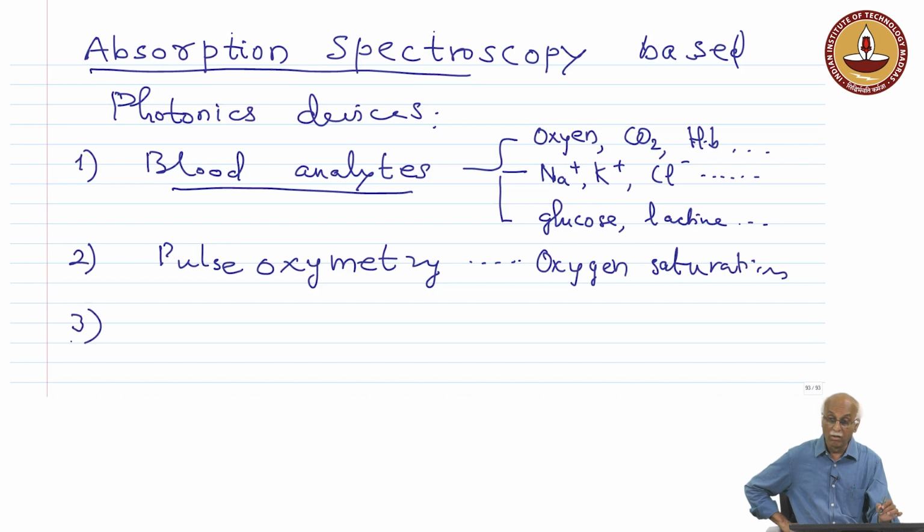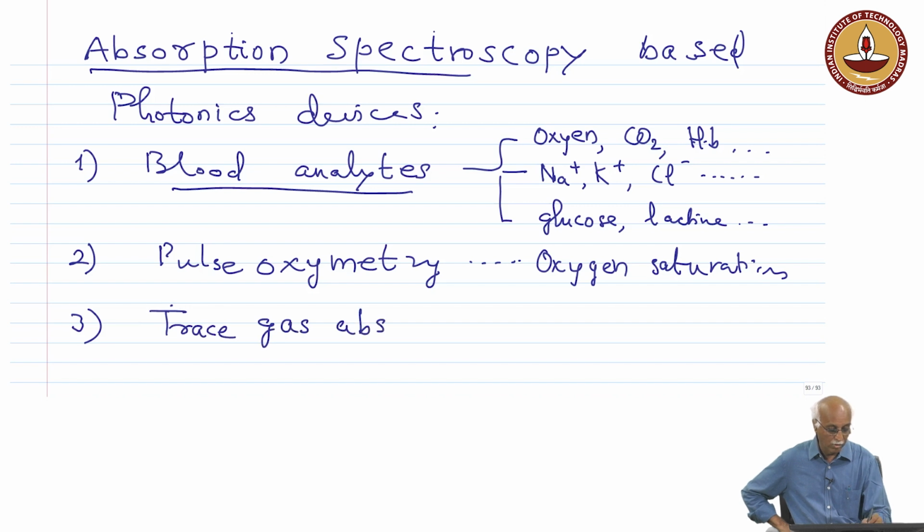There is one more application of absorption spectroscopy related to our biophotonics devices, and that is based on molecular gas absorption, trace gas absorption, for capturing biomarkers.